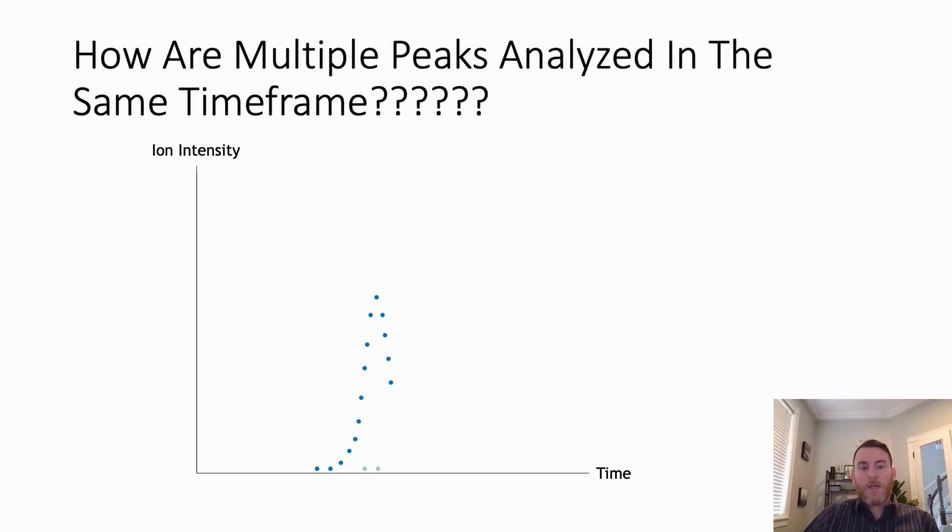You're effectively acquiring data, but you can see now you have compounds that are overlapping. They look like they're overlapping, but in reality, they are not. They are being detected in independent time frames that are so small that it looks like overlap when in reality you're actually getting independent acquisitions.